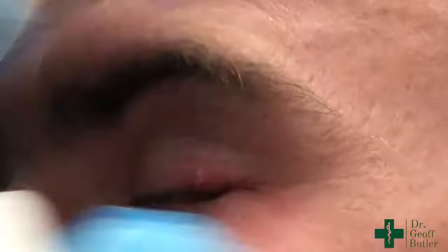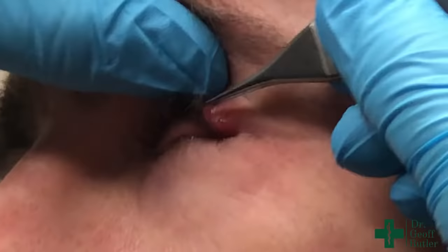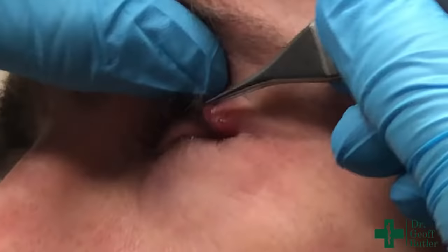There's still a little bit of a pocket up here, so I'm just going to see if I can drain that a little bit more. Now that it's open, I'll encourage him to use warm compresses and this should start to drain out and clear up for him — and that's it.